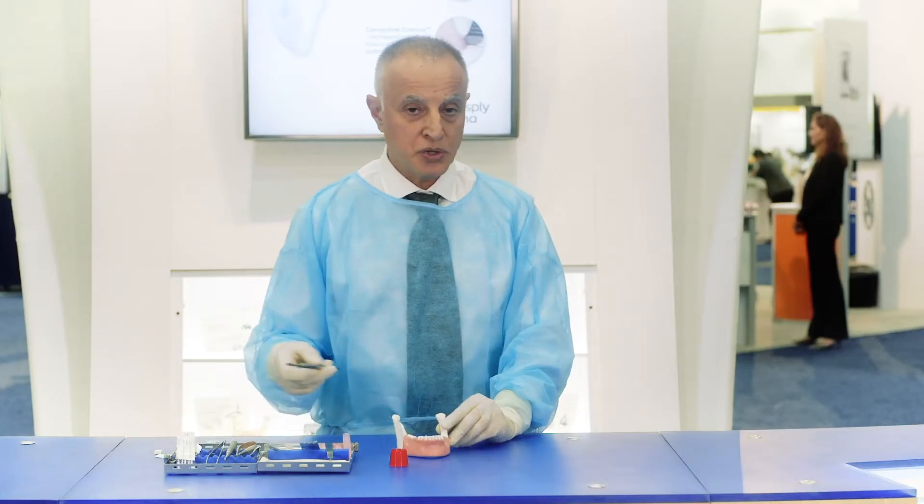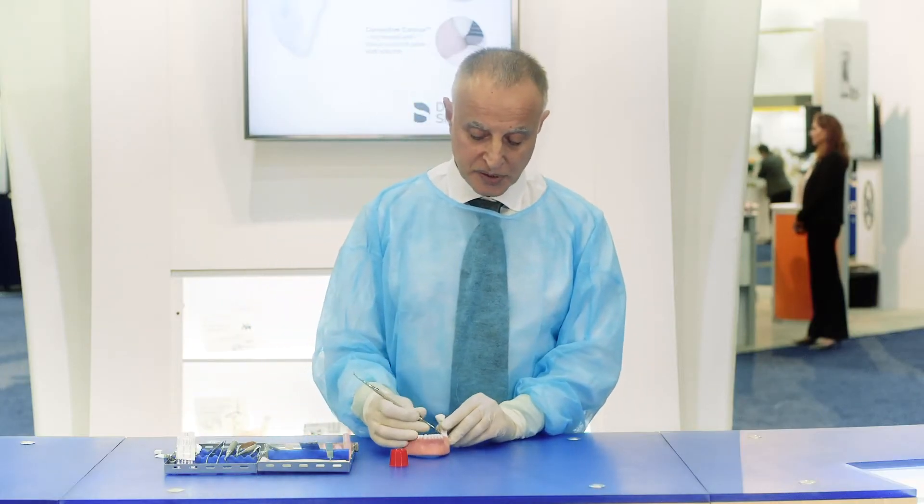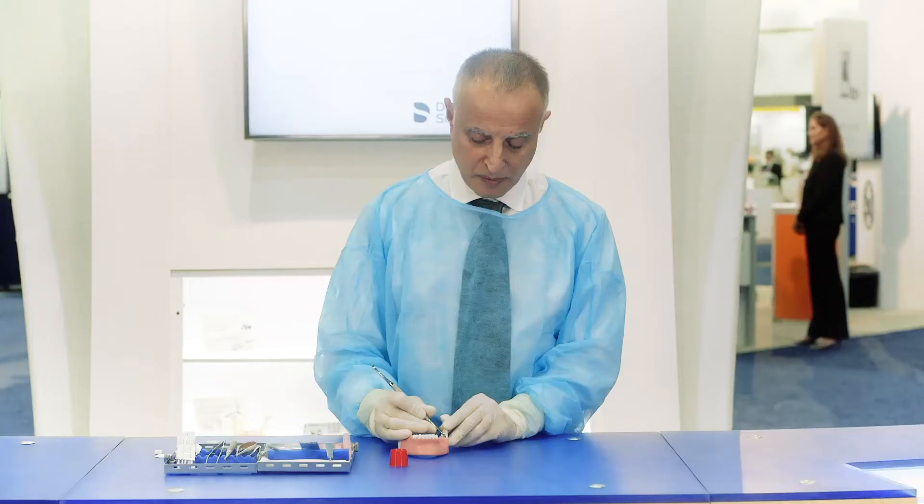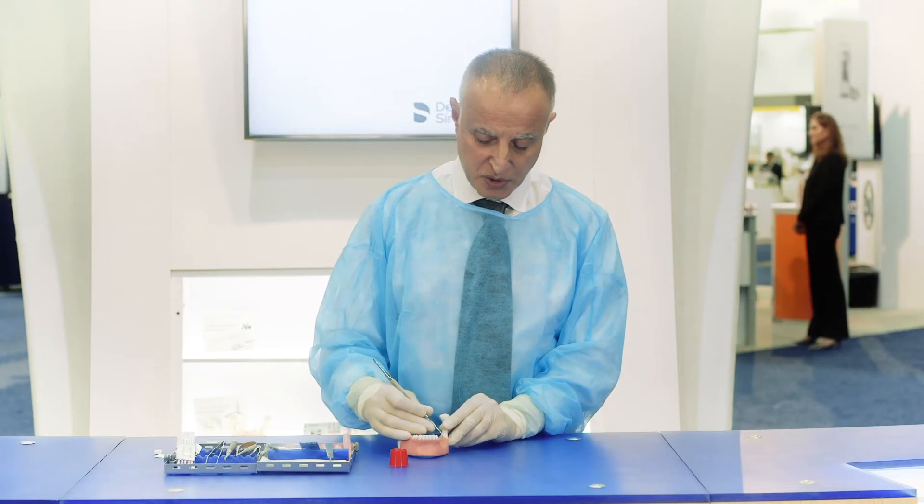Now we go on to using the periosteal elevator and we gently elevate the tissue. I'm going to fully expose the edentulous ridge.